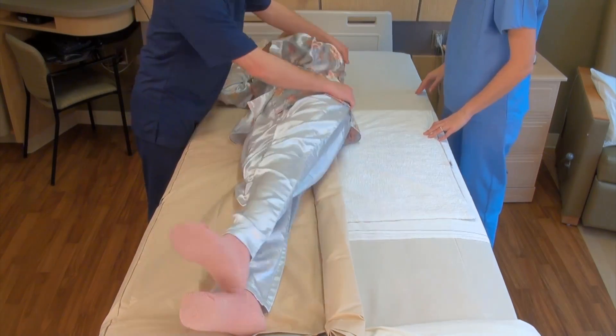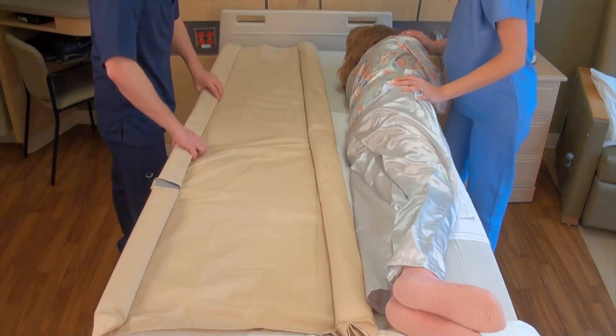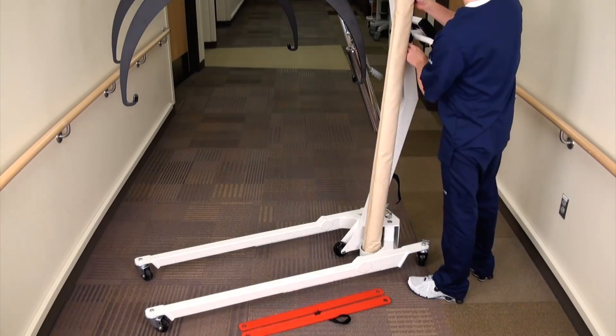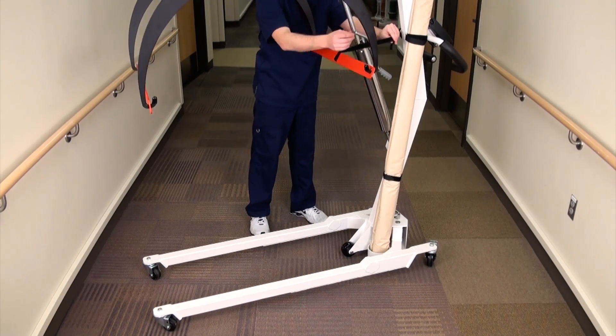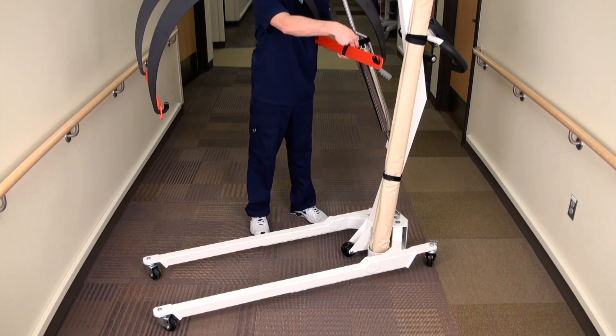To remove the stretcher from underneath the patient, follow the same steps as before by rolling them first to one side and then the other. Replace the stretcher into the stretcher cup and using the Velcro straps fasten it to the column. Place the transport bars back onto the support hoops and secure the bar closest to the column using its Velcro strap.